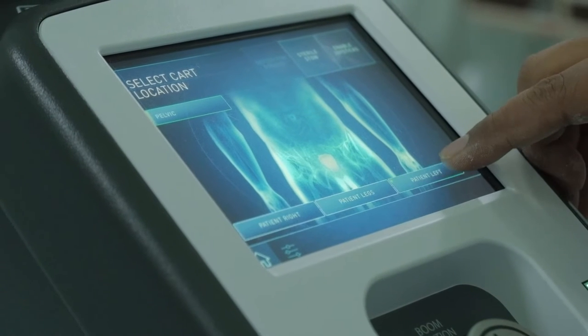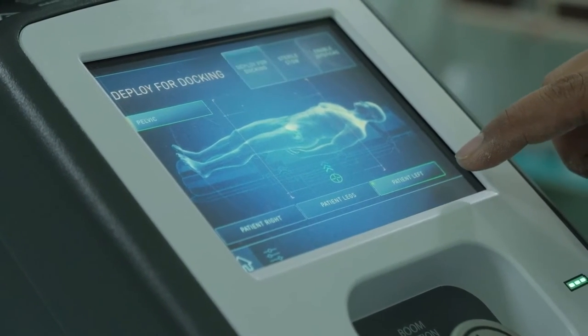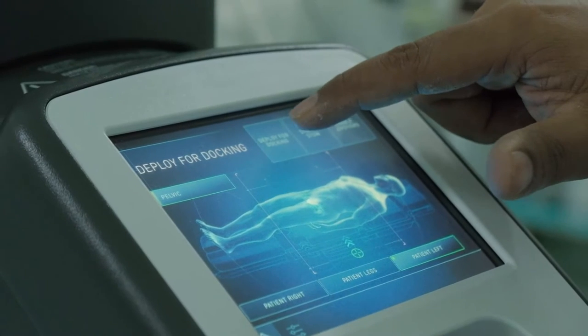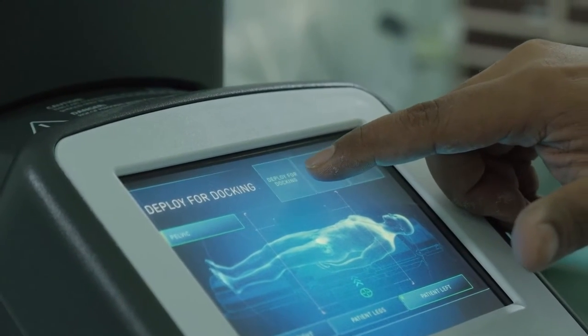So which side the patient cart is coming from. So here we select the patient left. So now you see that the patient cart is coming from the patient's left, and we have selected the pelvic anatomy. And then we press deploy for docking. Then the boom is going to move.